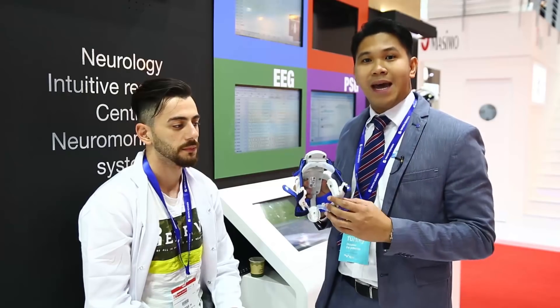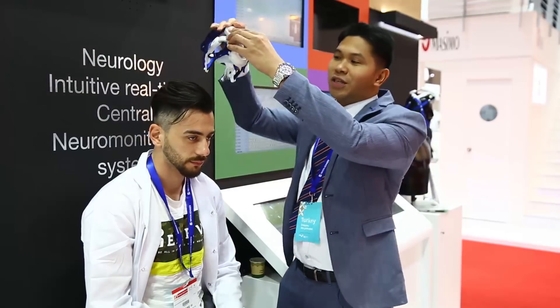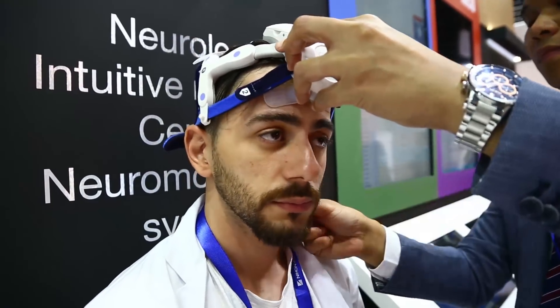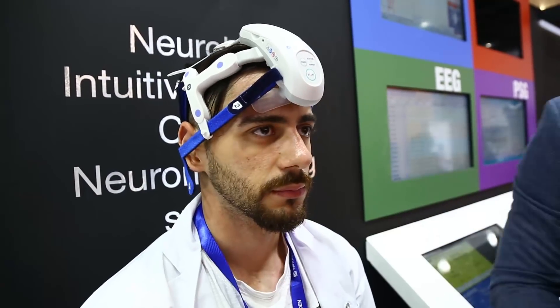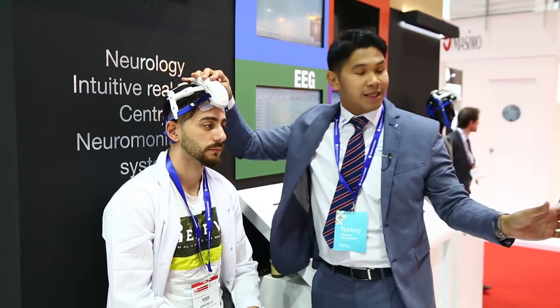I will show you today how to easily attach the EEG electrodes on the patient. First, you just have to position this silicon rubber on the forehead of the patient, then just snap it in at the back, and we can secure another foam here.